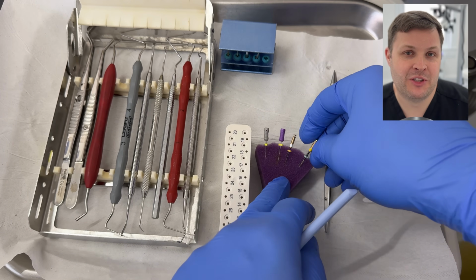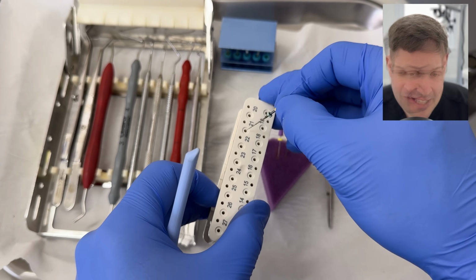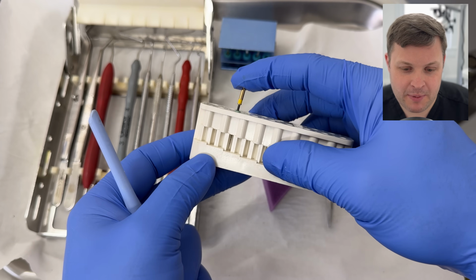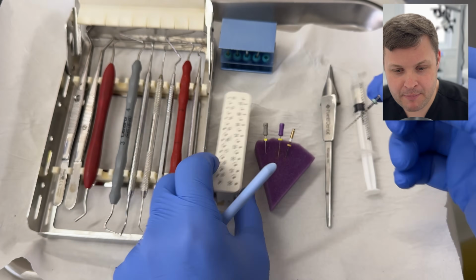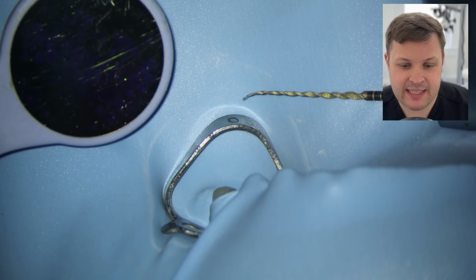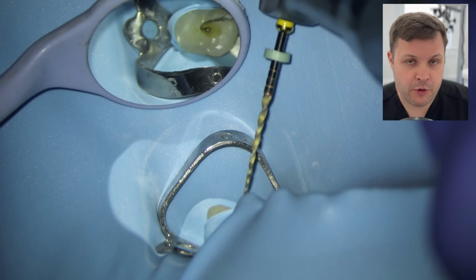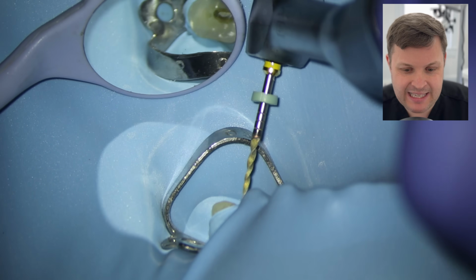And then we're ready for the 20 master apical file. And this is a Hi-Flex. And the great thing about these, you can also put a bend in these. So I'm going to just shape it to 21.5, so 0.5 millimeters away from the 0 reading. I'm going to make a tiny little bend at the end, and then I'm just going to use this in T mode again. And sometimes it can be a bit difficult, but I know at the point where the sort of ledge or the catch was, it's about 18 millimeters.